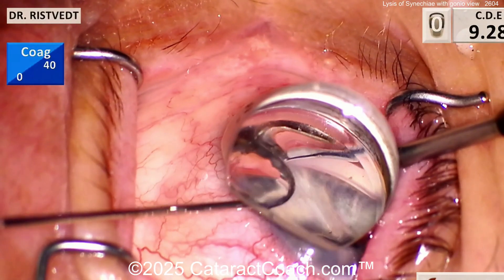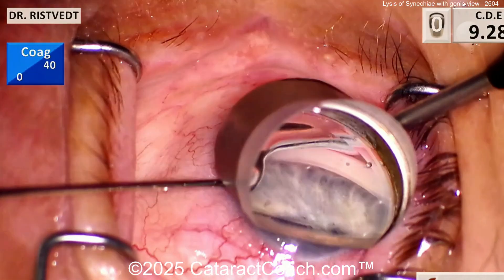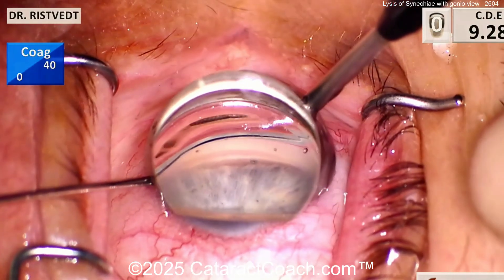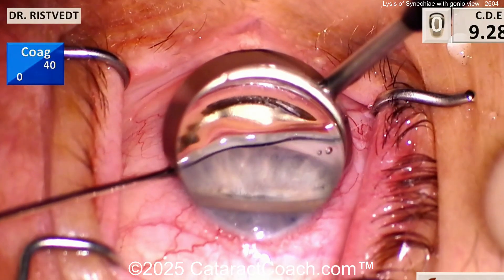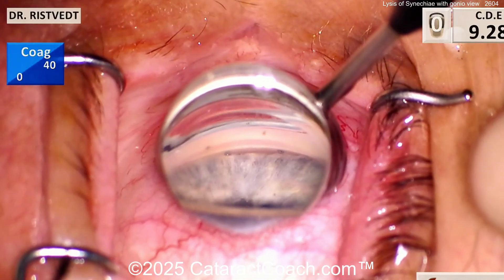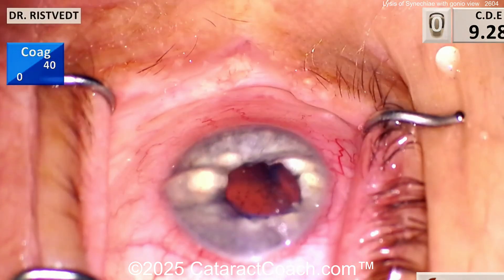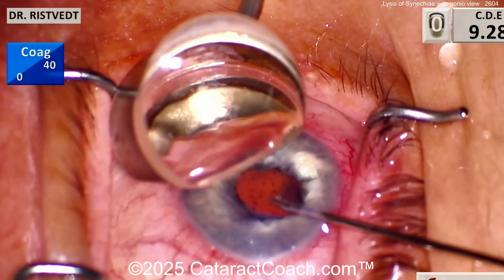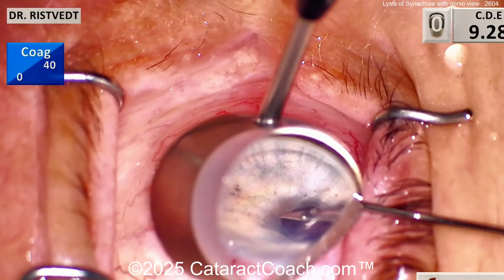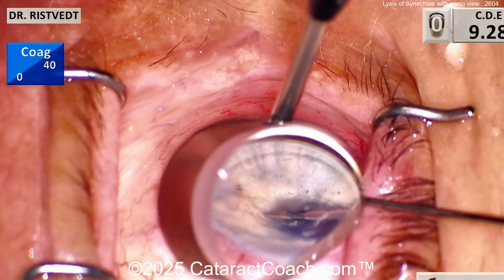Very good job here. The beauty of that gonioscopic view is that you can actually see it in action. To maximize that gonioscopic view, you want to tilt the patient's head away from you - so you're sitting temporally and you tilt the patient's head away from you. At the same time, you move your microscope and angle it towards you. The combination of those two with the gonio prism will allow you to see the angle very cleanly.